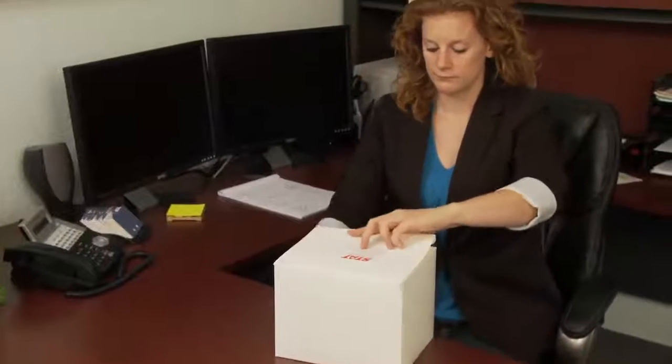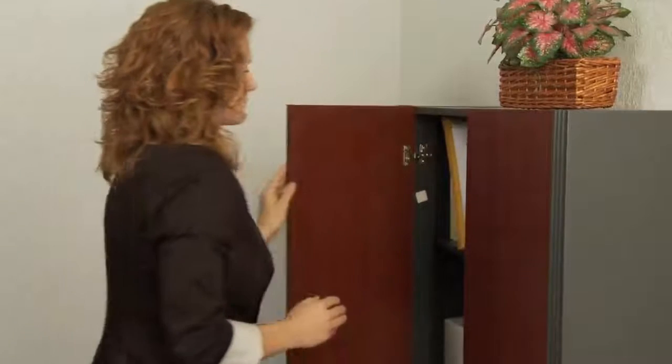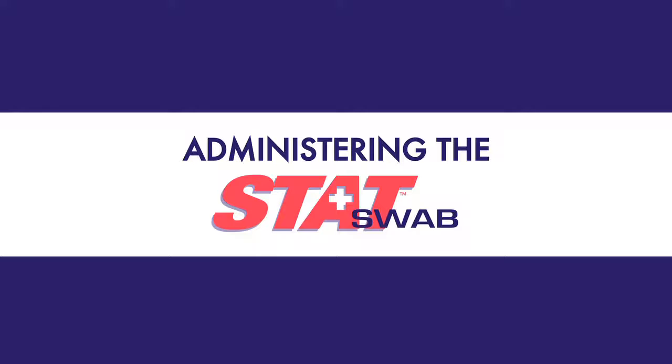To properly store STATSWAB tests, keep them at room temperature. Do not expose tests to hot or freezing temperatures for a prolonged period of time. Adhere strictly to the expiration date on the foil pouch, and do not use tests beyond that date. Also avoid opening the foil package until it is time for the test to be performed.